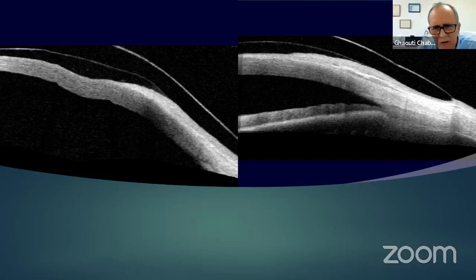So, of course, you are doing specialty lenses most of the time. Most of the time, you don't do general optometry. No, we don't do anything with eyeglasses. Everything we do is contact lenses, mainly scleral lenses. Okay, that's right. It's really a new development, I think. With OCT, we can see the clearance, we can see the landing, we can see everything, and we can also manage to see even the angle.